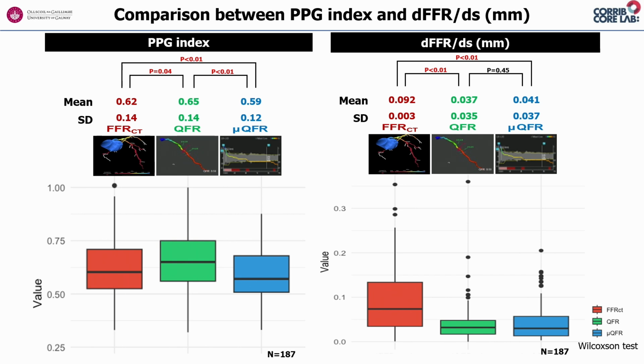You know, it's a very interesting story, because if you think about it, what is determining a gradient? A gradient is determined by the flow and the anatomy. It was a long discussion with Nico Pijls in '91, when he wanted to introduce the pressure measurement of the gradient. I said, I'm sure you have to do it because the anatomy is poor and the velocity is poor. So for almost 2 decades, the gold standard validation was versus the pressure. But I can tell you, when the anatomy gets a resolution of 20 micron, 10 micron, 2.5 micron, as I was mentioning, the finite element of that plus the flow will be superior to the pressure. The pressure is just 1 point.